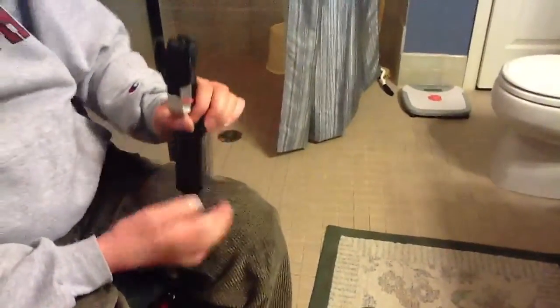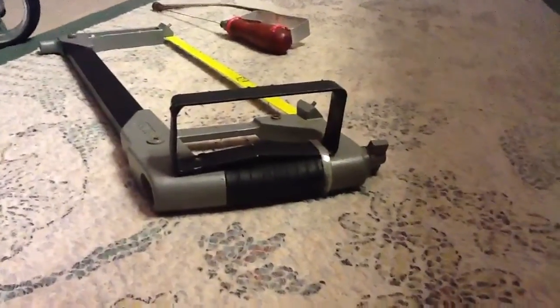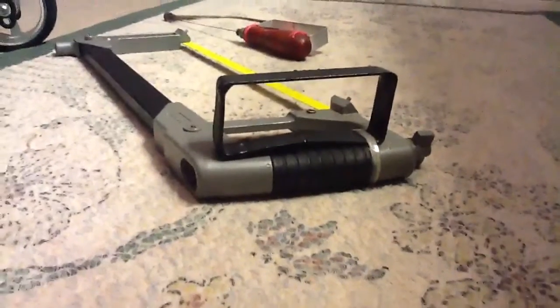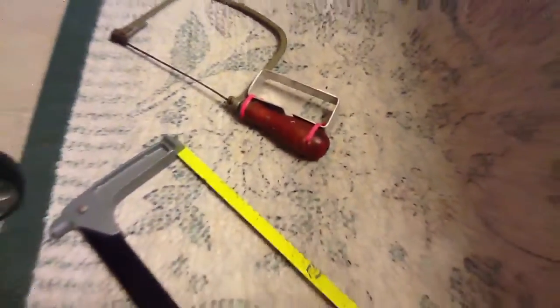Here are two other ways I've done it — one is for a hacksaw and one is for a coping saw. You can see they're a little thinner metal. The hacksaw is actually broken right now, but you drill a hole through it and go through it as many different ways as you need to make it steady. Once you make the hacksaw adapter, you can use it to cut the bar. These are just some different ways I've done it; you can experiment on your own to see which works best for you.